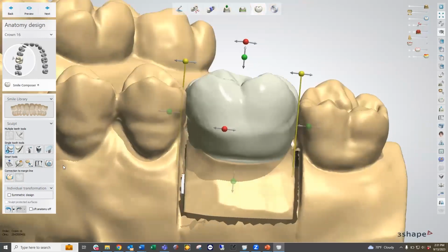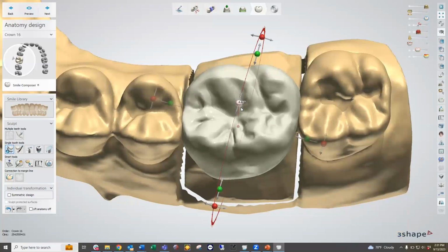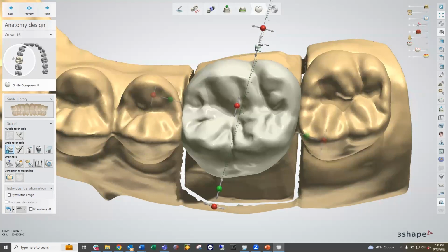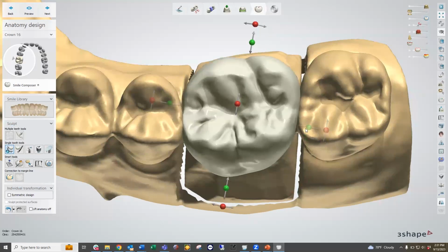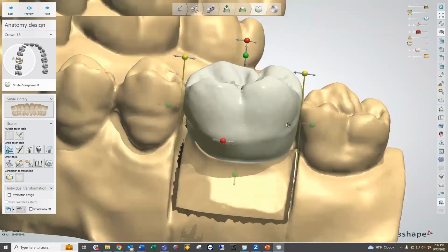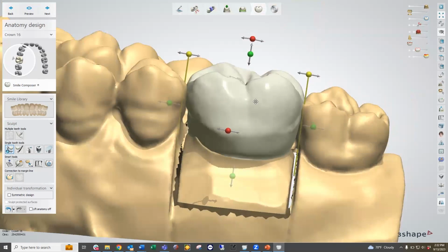So again, going from left to right, we're starting with our big changes, just making those generalized changes. I'm going to rotate this crown so that I have the same style of ratio from the top view as we do with our neighboring teeth. So I'm going to rotate it into view and make the necessary adjustments. If I have to pull out or suck in any areas further, I can do that with multiple tools down the road, but I'm just going to make my big changes at this point.